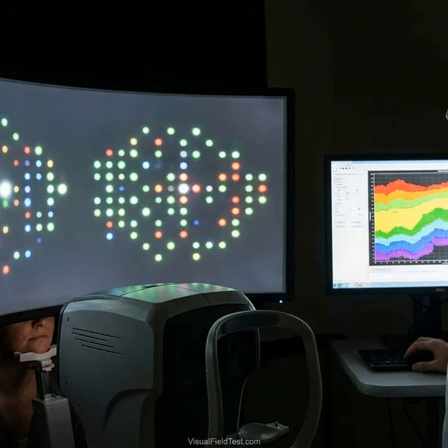In summary, targeted color and flicker tests can sometimes signal trouble before standard fields. SWAP may uncover some early losses, especially in the short term, but it does not consistently outrun SAP in all patients. FDT might reveal a modest number of earlier defects. Therefore, these tests are best seen as complementary. If a targeted test becomes abnormal, it raises concern even if white-on-white is still normal. But a normal color or flicker test does not guarantee stability. Longitudinal studies suggest that both approaches should be used when possible, and field changes confirmed over multiple tests.